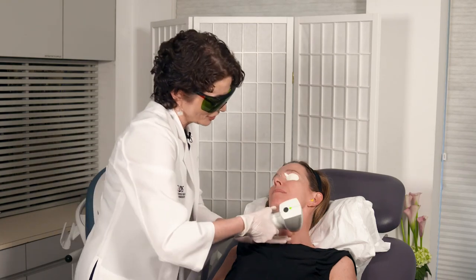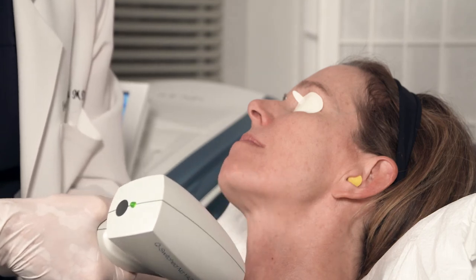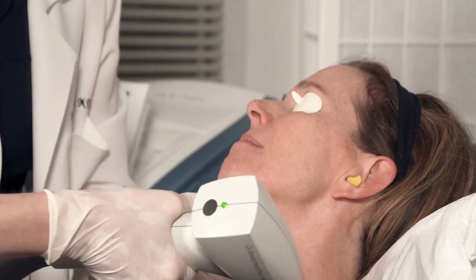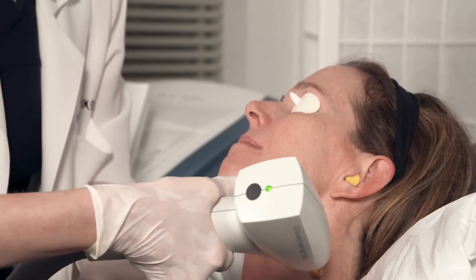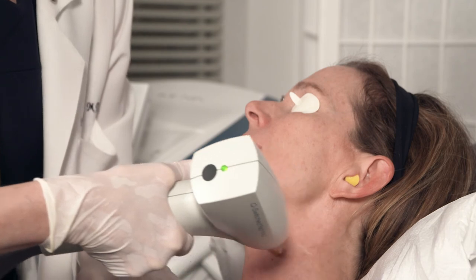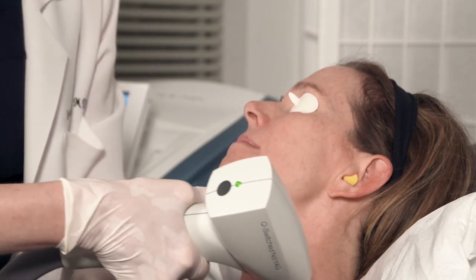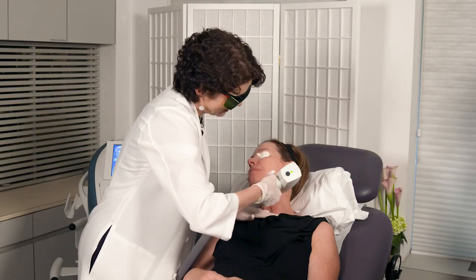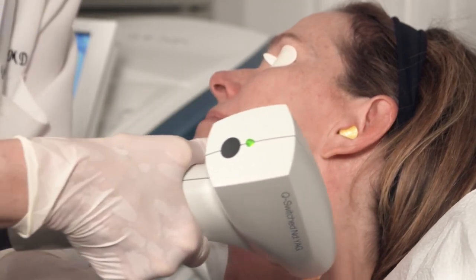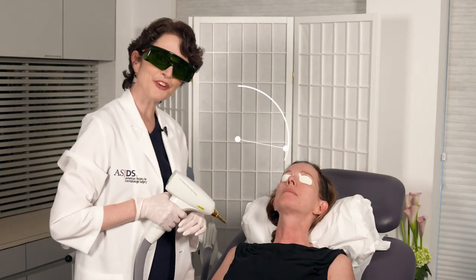Further out where some of this poikiloderma is, you start to hear a little more of that acoustical effect. What I'm targeting here are the melanocytes and melanosomes — their thermal relaxation time is in the realm of nanoseconds, and this nanosecond laser is specifically aligned to target that pigment without creating too much collateral heat. She will be a little pink, and the neck will lag behind the face in how long the pinkness lasts.